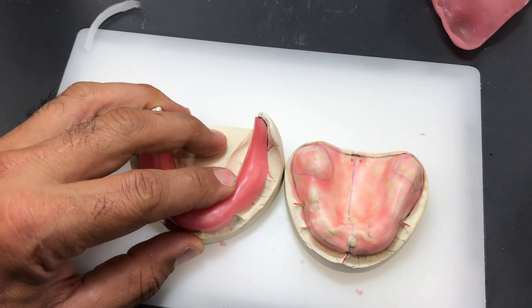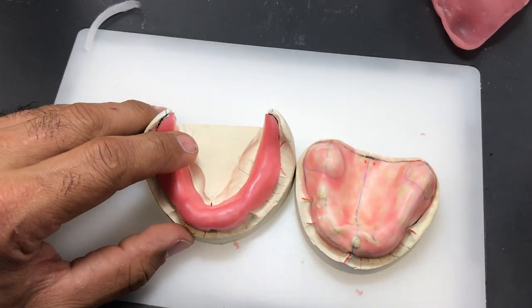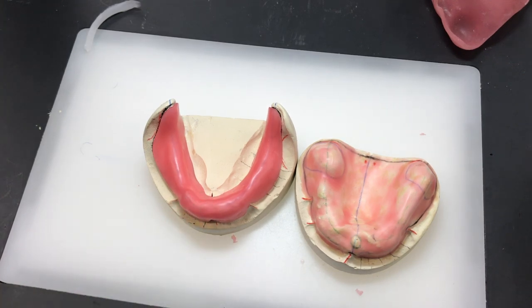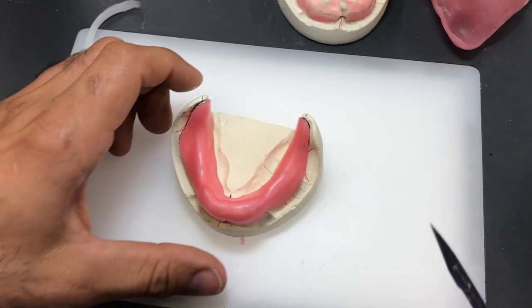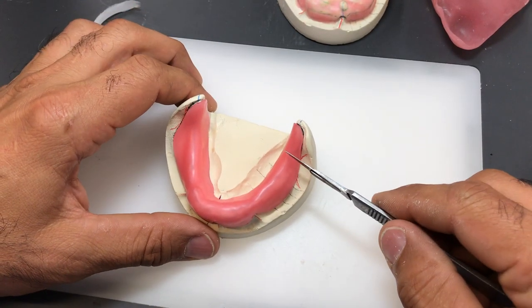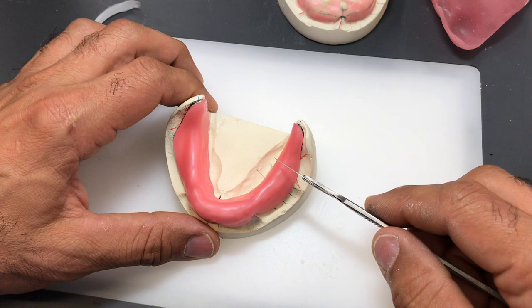And the final step into producing a custom tray, or at least a blockout for the custom tray, when using a wax spacer, is we need to incorporate what we call tissue stops. The tissue stops will maintain the space that we're creating in wax in the patient's mouth. And the way we do that is we take our surgical blade and we're going to create four tissue stops. One just before the incline here, which is just before the retromolar pads, usually around the 6 area.